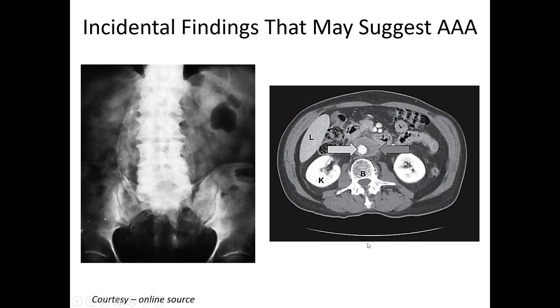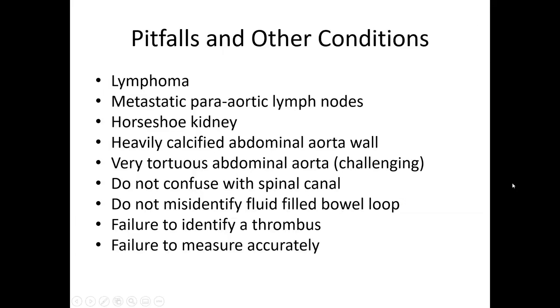Here it is, you can see a CT scan was done and you can see clearly an opacified lumen of the aorta, and of course there is a large thrombus. So thrombus is going to be part of the aneurysm. You will never see an aneurysm without clot if it's large size.